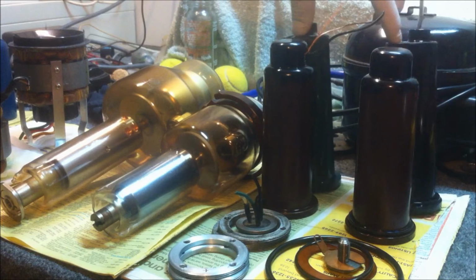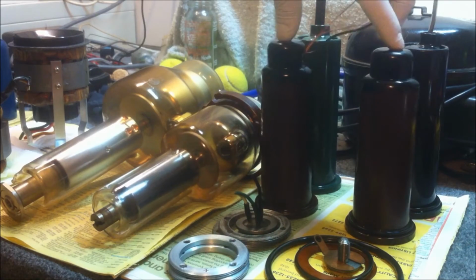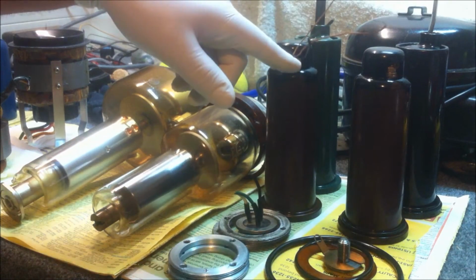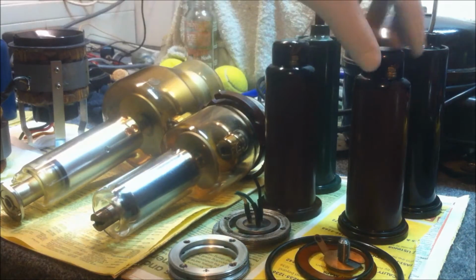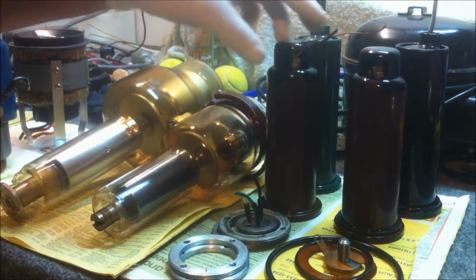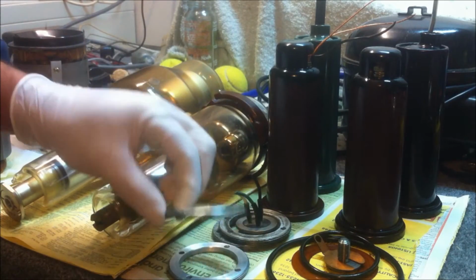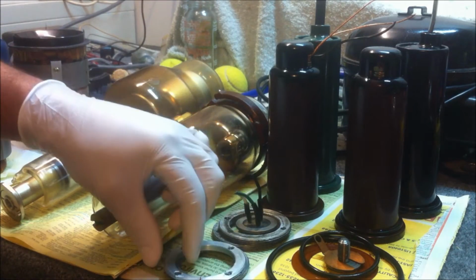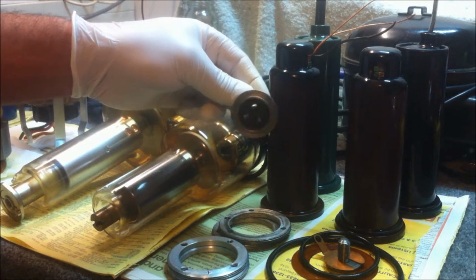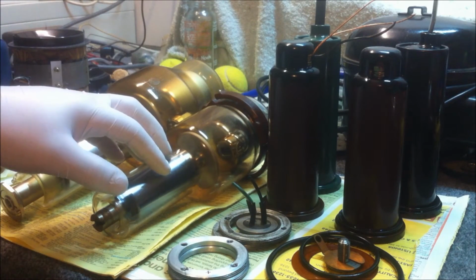I've got a set of female federal connectors here, these receptacles at the back, and I've got another set here. Terminations on these ones are under the caps here. See, we've just got some brass nuts on some brass studs there, and just standard ring terminals on the ends of the wires here. They've got the O-ring seals, which I've kept, and I also kept the aluminium locking rings that hold them down to the face panel. Also got a high voltage feed through here, and I kept both of the X-ray tubes themselves.